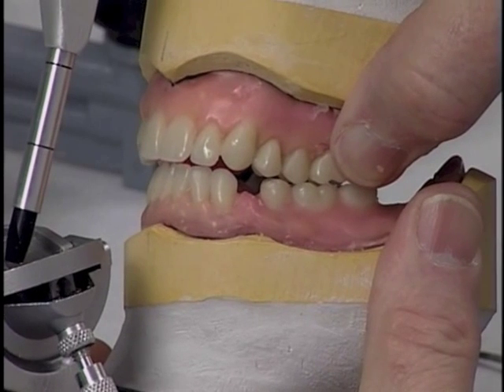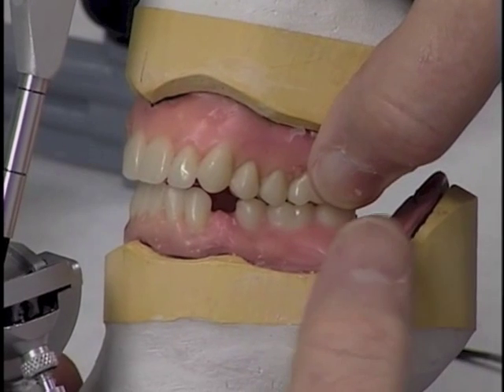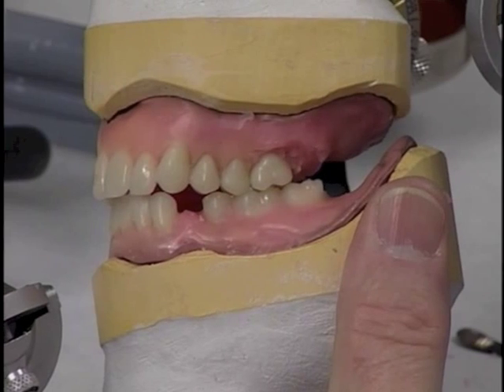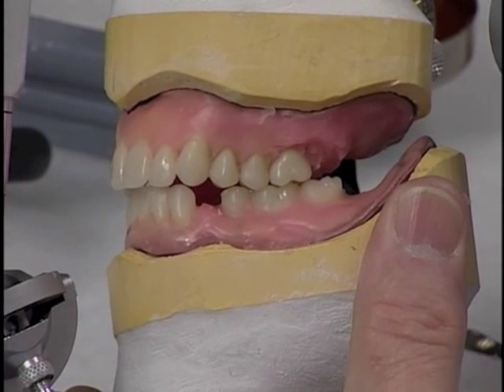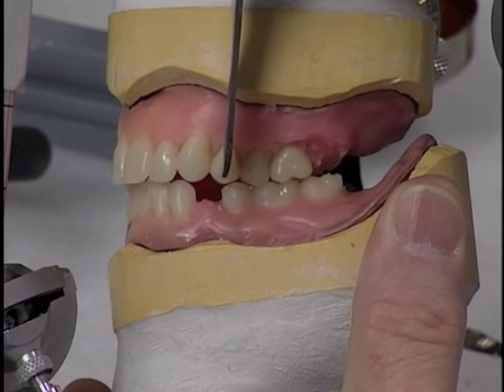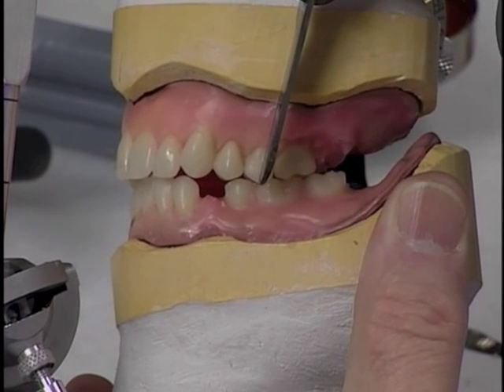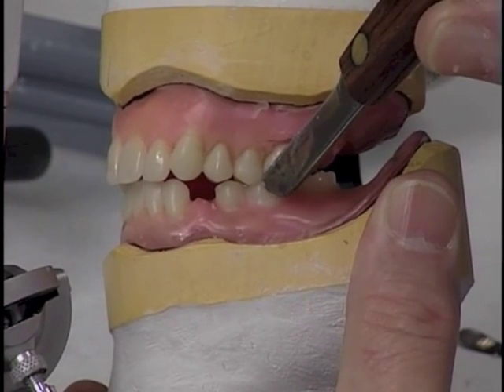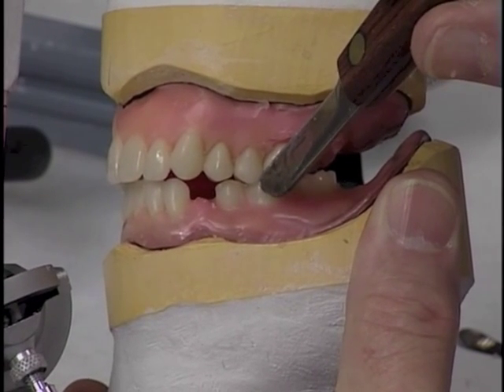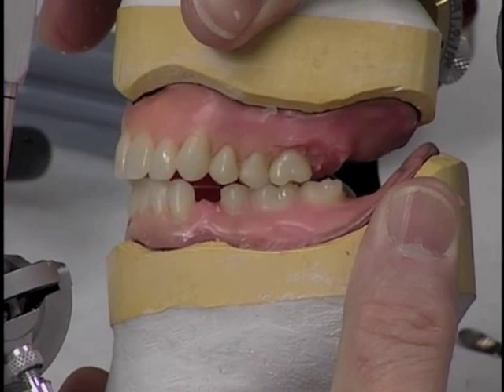And we're getting pretty good, except we're just a little high with that distal buccal cusp of the maxillary second premolar, and I can see why that is happening. If we look at the long axis of this tooth, to vertical or 90-degree angle to your occlusal plane, the second premolar is a little bit tilted mesially like this, which lowers this contact, this slope of the buccal cusp, the distal slope of the buccal cusp. It lowers it. And as you can see, that's where our interference is at this point.